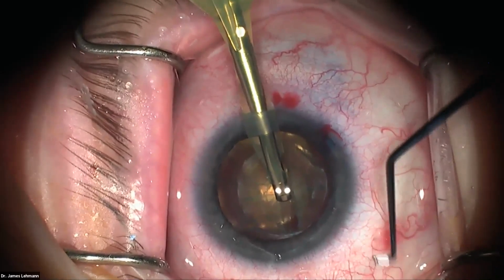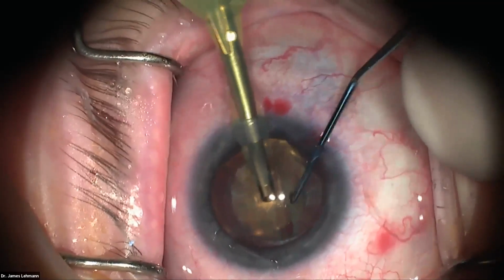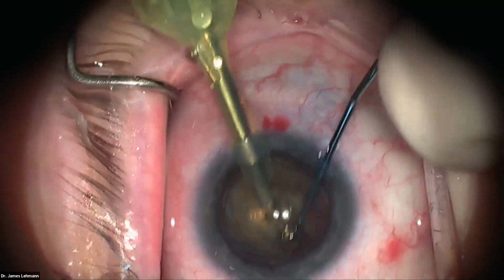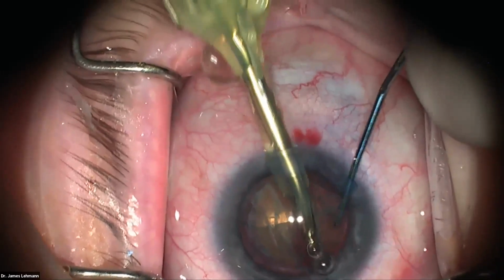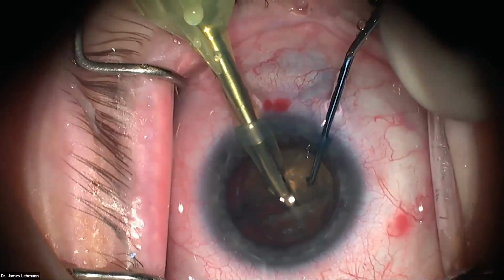And then this is my second instrument, which is called a chopper. This is a horizontal chopper. You can see the tip is blunt. And we're going to put that through our paracentesis, and then we're going to do a little bit of quadrant cracking here. So we open that, and you're going to see some bubbles come forward. Those were there from the laser. And now we're going to eat those up. And we're going to rotate 90 degrees. Do the same right here.